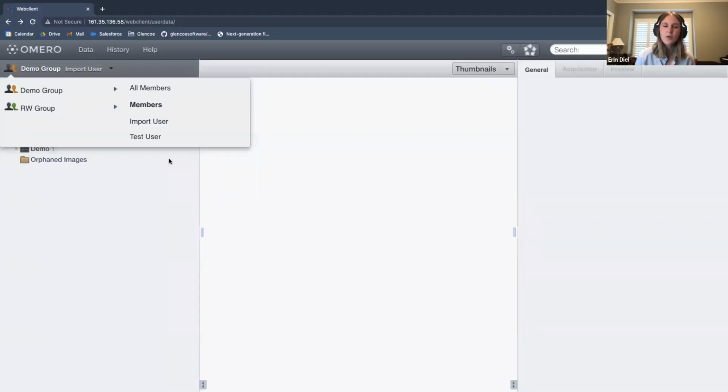And so those might be relevant to some people on the call today, especially if you're a lab manager or a PI, or you have a particular use case where you want to be able to create and do that sort of administration tasks. So happy to talk about that in, say, an admin training session with a smaller group, but I'm not going to get too into the weeds today, but please let me know if you have questions.